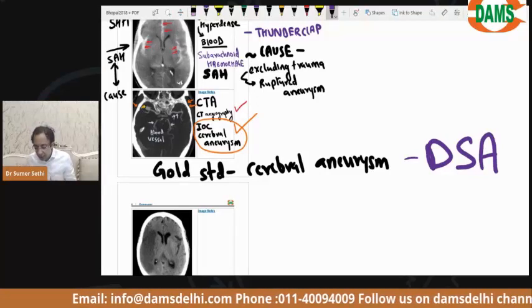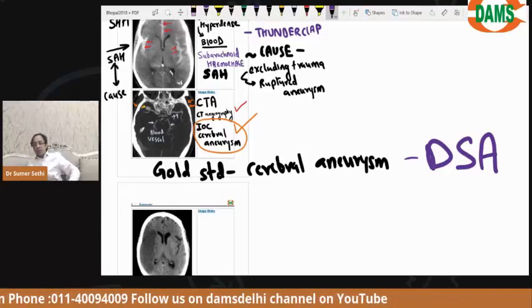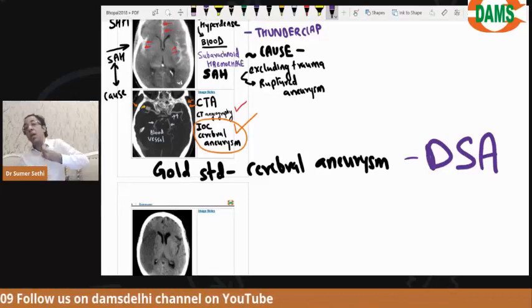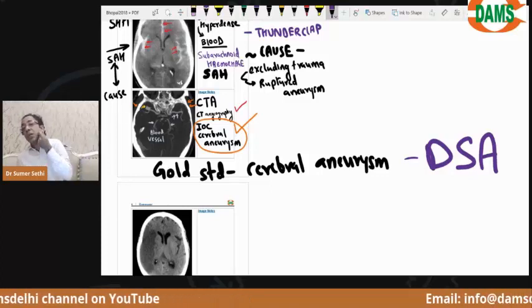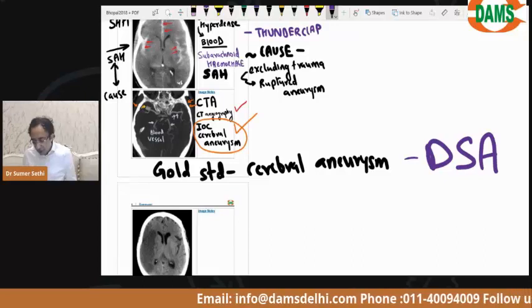डाई कैसे दी? कैथेटर से. कैथेटर कहां किया? आर्टीरियल पंचर करके we have taken the catheter from the femoral artery and we have pushed it into the aorta, from aorta से carotid artery, and we have injected the dye. Everybody understands this? Understood? Okay, अब समझ आया?